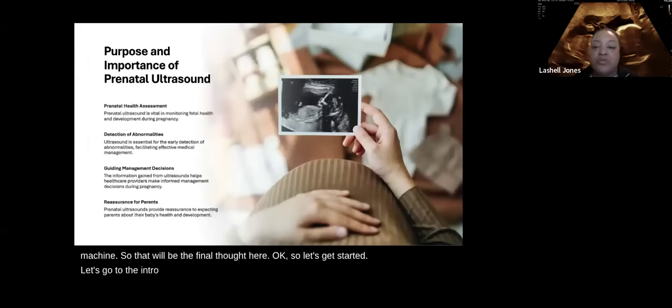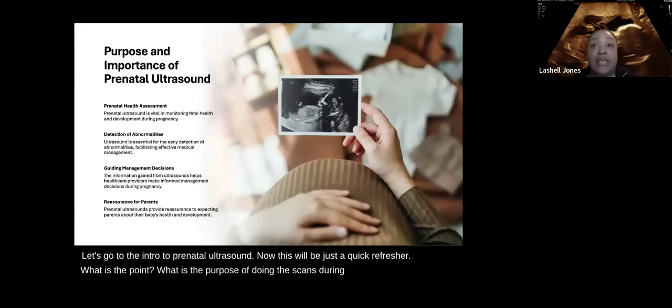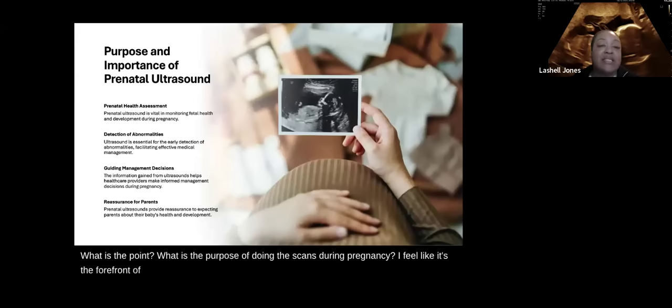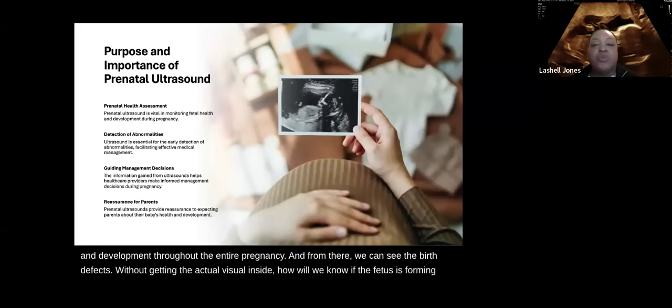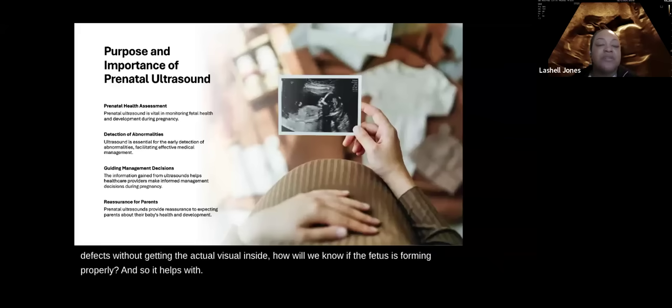Now, this will be just a quick refresher. What is the purpose of doing the scans during pregnancy? I feel like it's the forefront of the pregnancy. It's vital. It's especially vital in helping monitor the fetal health and development throughout the entire pregnancy. And from there, we can see the birth defects. Without getting the actual visual inside, how will we know if the fetus is forming properly? And so it helps with recognizing these birth defects.